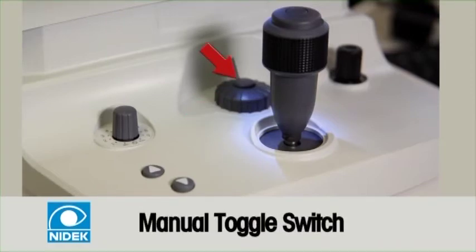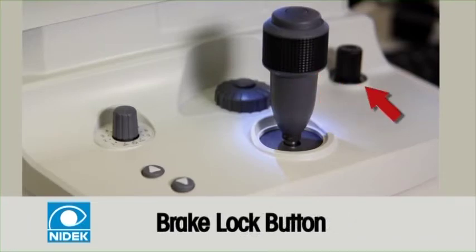The button in the center is the manual toggle switch. This will manually move the observation view from the outside of the eye to the inside. To the right of that, we have the brake lock button.